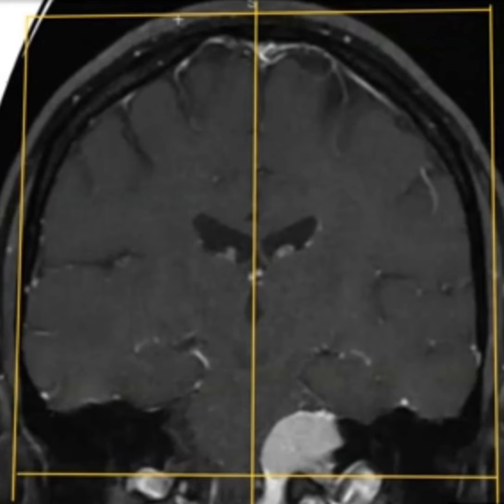And one neat trick is a time saver at this point, because once we set all those three, axial, sagittal, and coronal slices, we plan them, and at that point we can use them. We can copy and paste them to other protocols, like we did T1, let's do the T2, and so on and so forth. So that's pretty good.